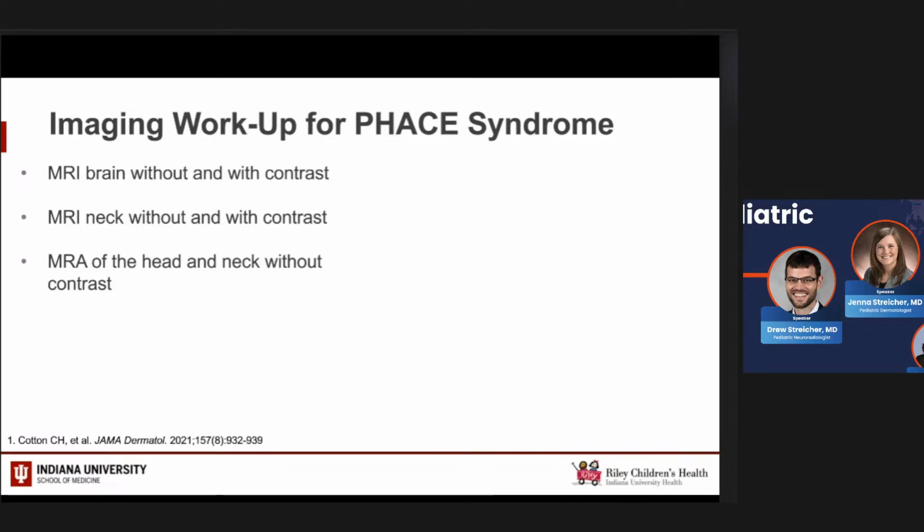These are segmental distribution on the face, so it's not like we're worried about deep extension typically to involve airway and things of that sort, but I guess that's probably why it's in. So maybe if it was going back into the orbit or something, that maybe you'd have better imaging of that region rather than just seeing that on brain imaging. But I haven't really understood why a neck is included in these.